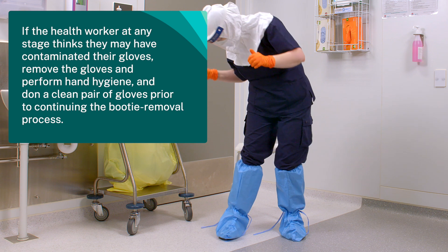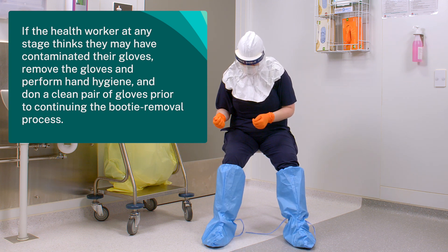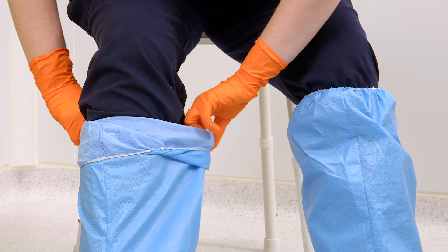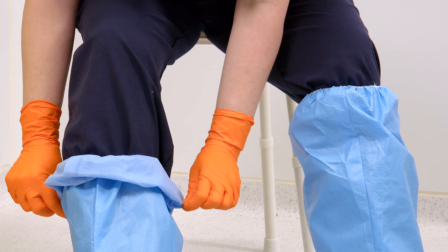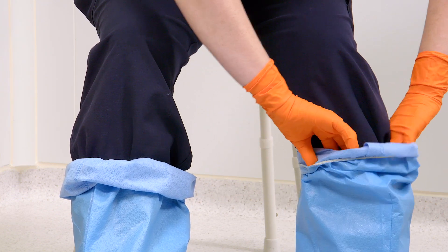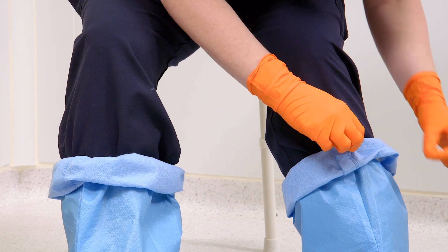If the health worker at any stage thinks they may have contaminated their gloves, remove the gloves and perform hand hygiene. Don a clean pair of gloves prior to continuing the booty removal process. Place hands inside the booty and turn the top down to form a clean cuff. Repeat on the other booty.